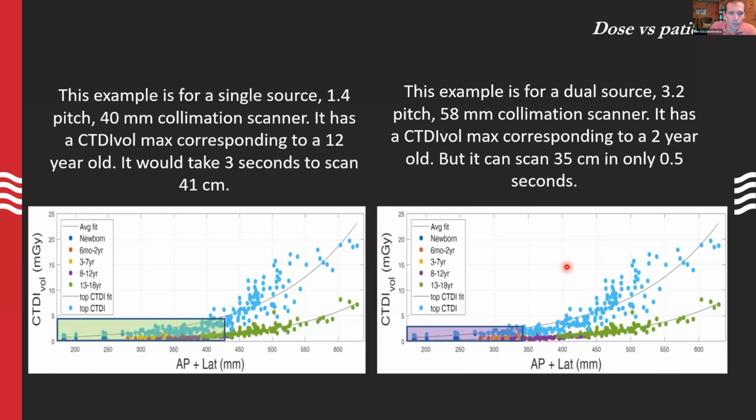Okay, so more on this theme of scan speed and dose. These are some protocols that I've mocked up that are pediatric specific, which is a really important place for understanding this, because for adults, if it's just a routine outpatient or whatever, you could tell them to hold their breath, and they're fine holding that breath for a few seconds or 15 seconds. But you're not going to get away with that with little newborns or little kids.